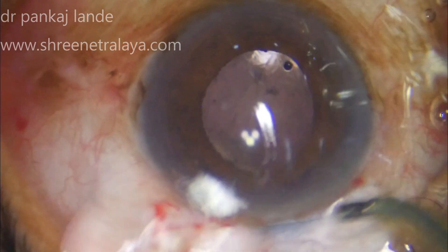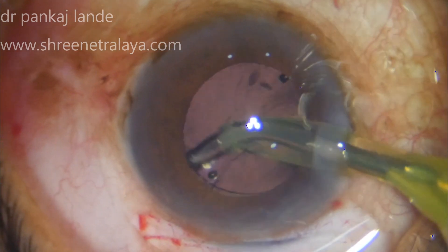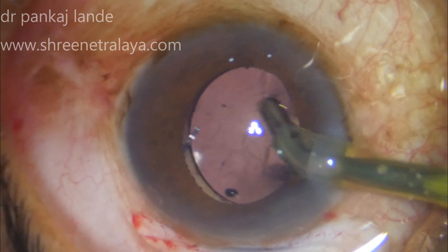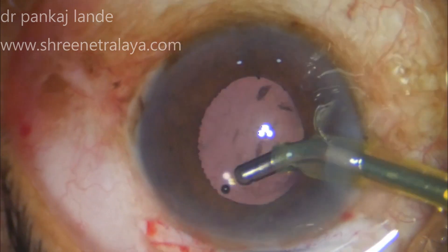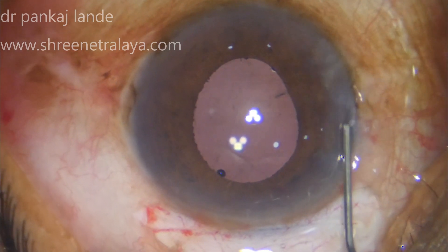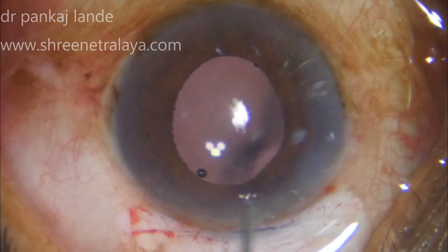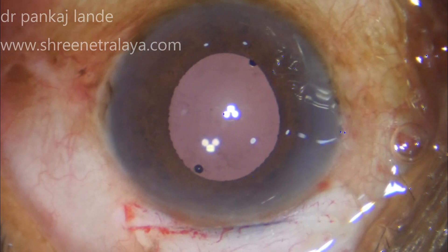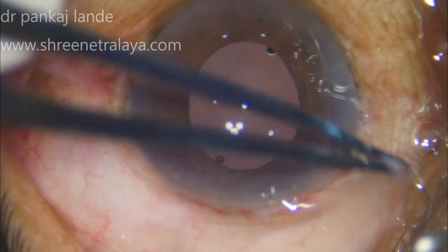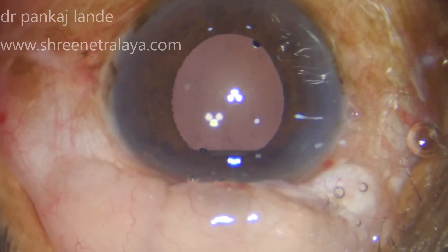This is followed by a thorough viscoelastic wash. Clear corneal wounds are hydrated and closed. Formation of the anterior chamber is checked, and if needed, air can be injected into the anterior chamber. I usually push my subconjunctival injection into the superior conjunctiva so that it covers the superior scleral tunnel.